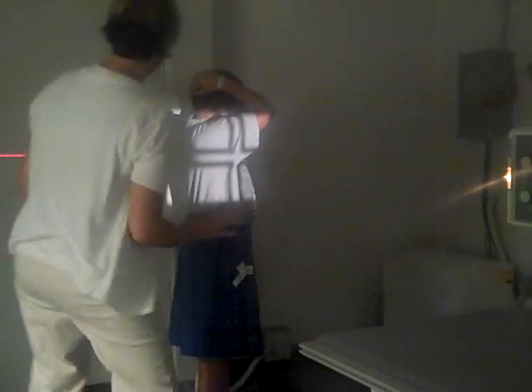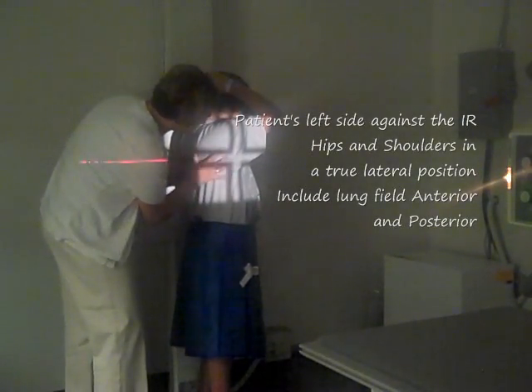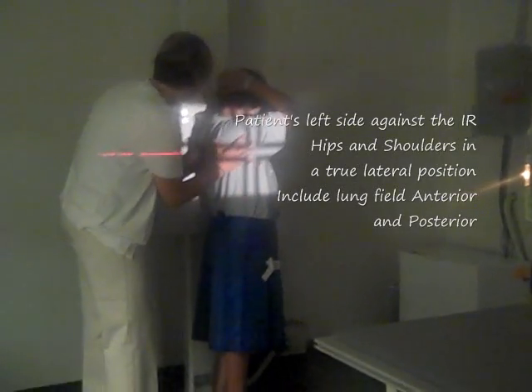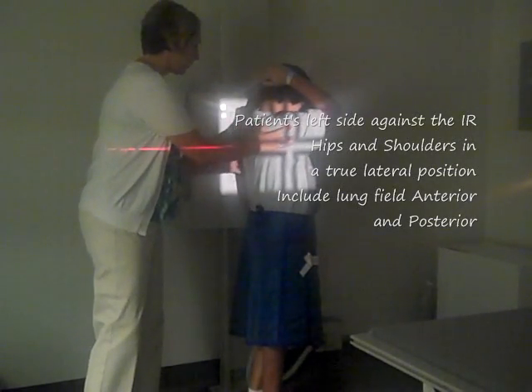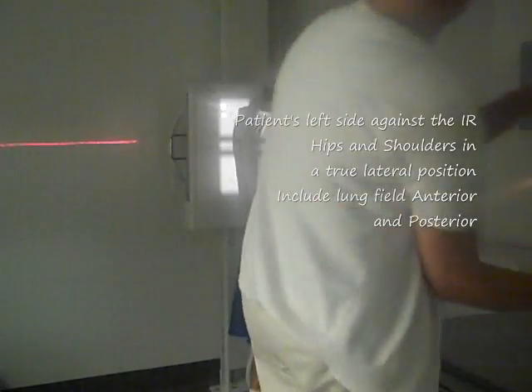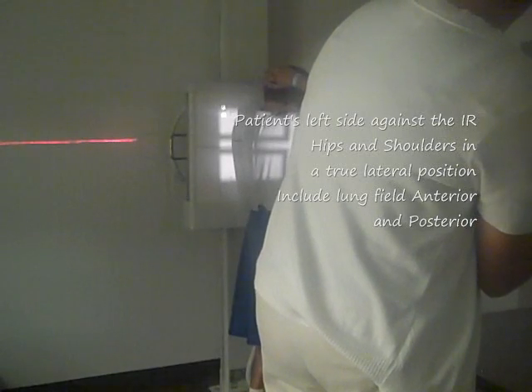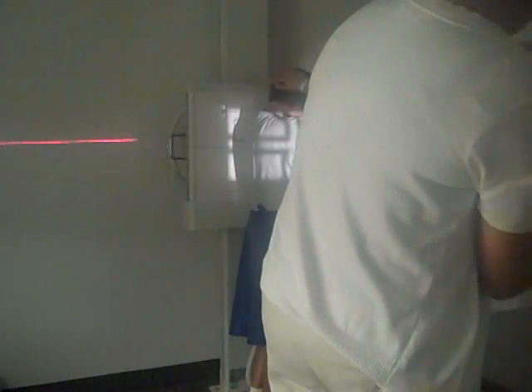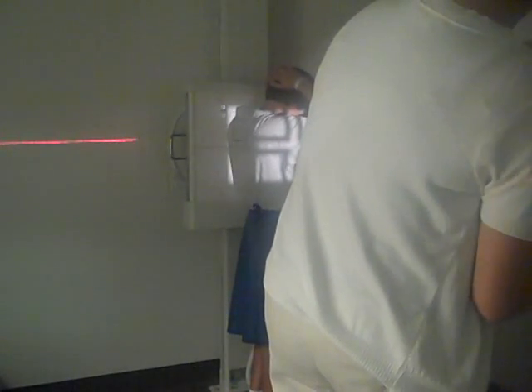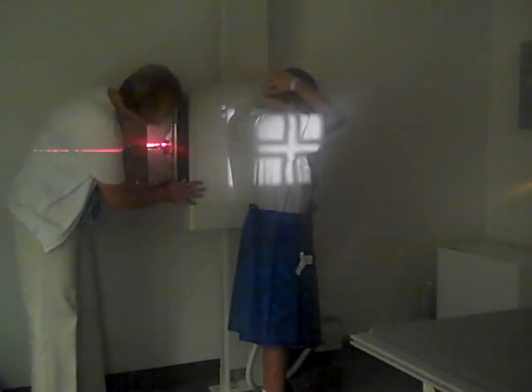Double-check with my light. With the lateral, I can collimate my film down just slightly. And make sure that we align our film.